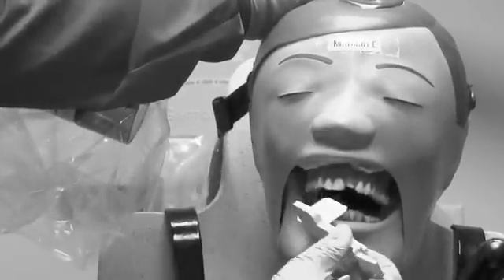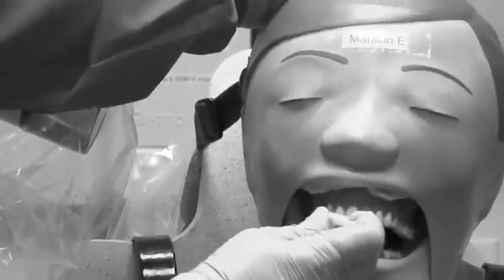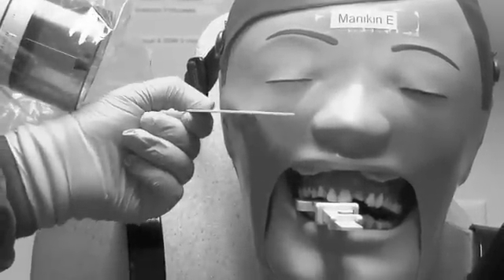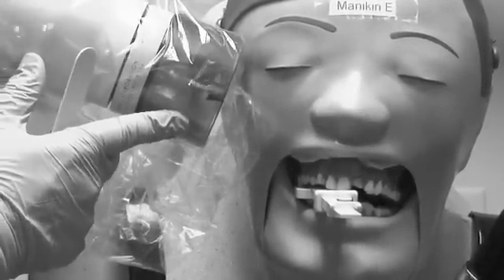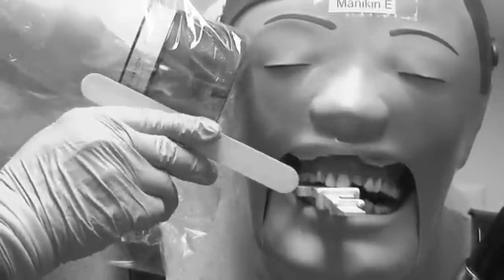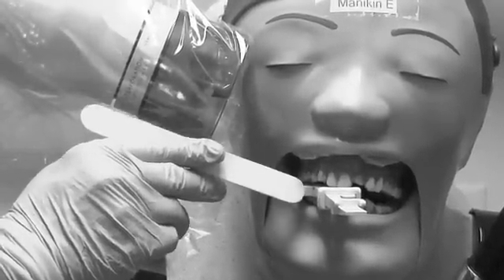We're going to use the tragus-ala line to keep the anteriors straight. We're going to have the front of the film at the mesial of the second premolar, with the chin tragus-ala line parallel to the floor. Our film is on the upper arch, so we're going to have our tragus-ala line even with the red line. To be sure we don't cone cut, we're going to go down the side of the PID to line it up with the front of the holder, ensuring equal distribution only on the upper arch where the film is located.